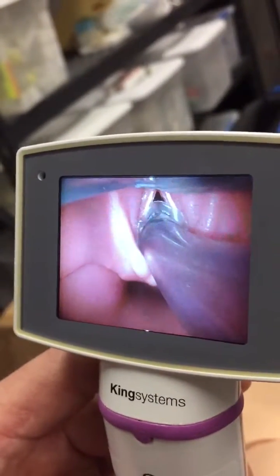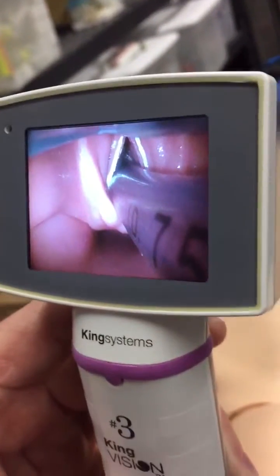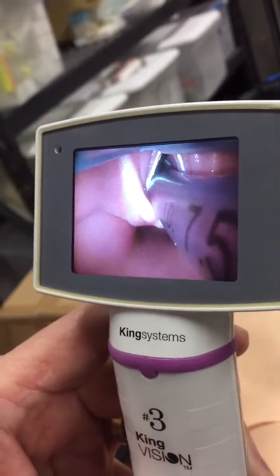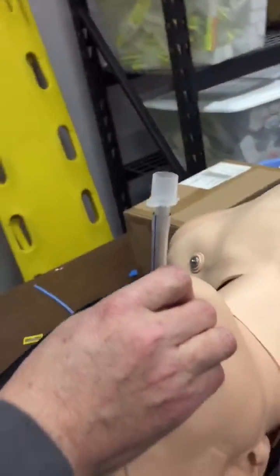We'll see how easily that tube passes through the glottic opening. I can see the cuff of the tube pass completely past the cords, and that's about as far as we want to go. As soon as that cuff gets past the cords, we remove the King Vision.